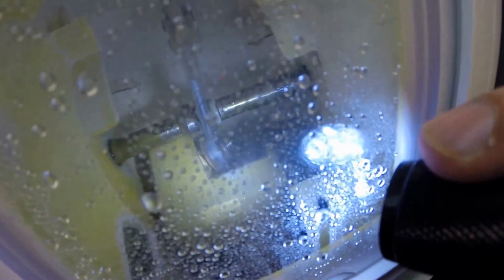All right, so the water's running. In that last 20 seconds, the safety bevel is being applied to the rear surface of the lens.